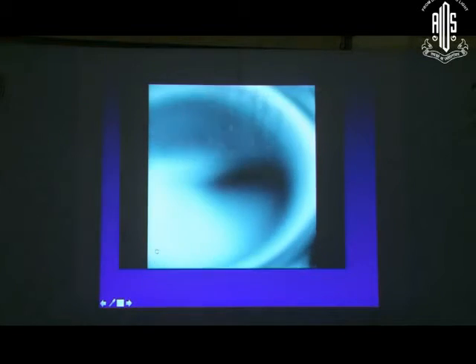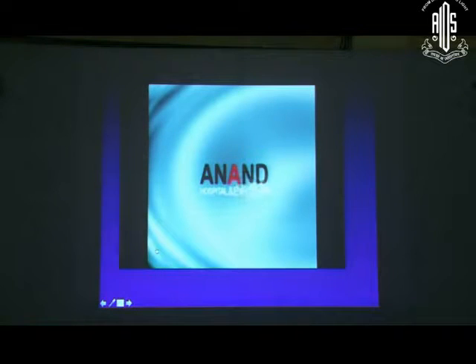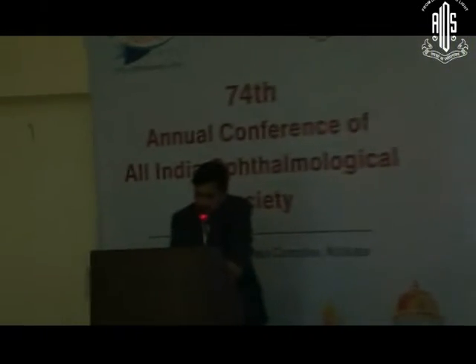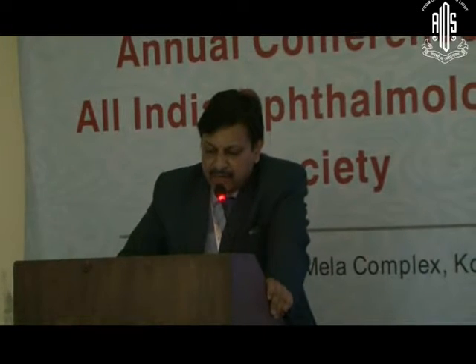Now this is another video which shows a small pupil, and we have done an AGV with cataract. So after addressing the AGV, we have put in the implant here, if you see here, and this is a white cataract, but the pupil again is bound down. There are a lot of synechiae. The patient has had uncontrolled pressures. This is post-uveitic.